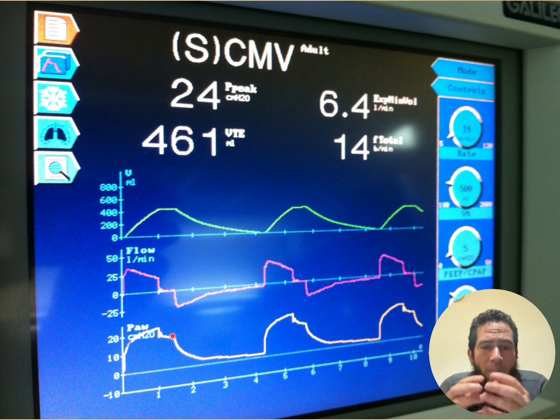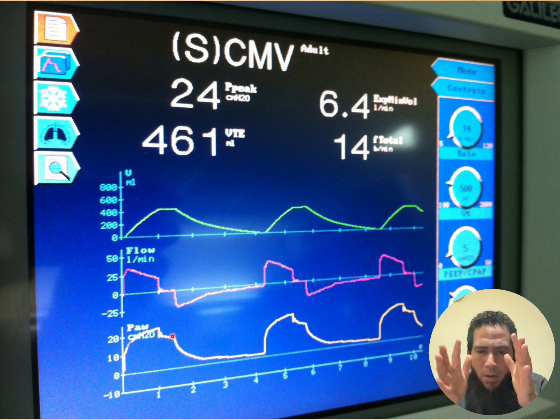Then we spoke about the basic modes of mechanical ventilation. Nowadays, modes are changing and getting more complicated, but it doesn't matter. As an A&E doctor, for example, you need to know the IPPV or assist control mode that you will use on our Oxylog or portable ventilator machine.